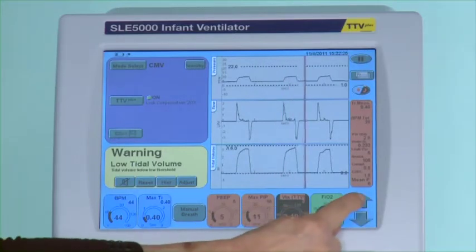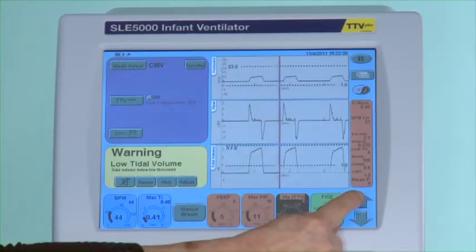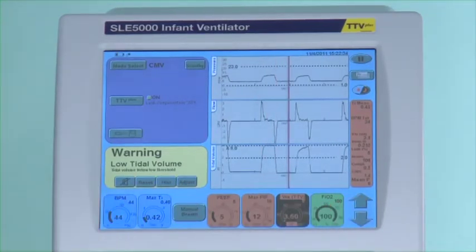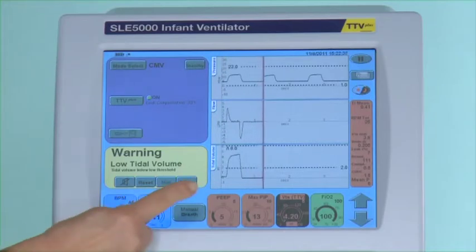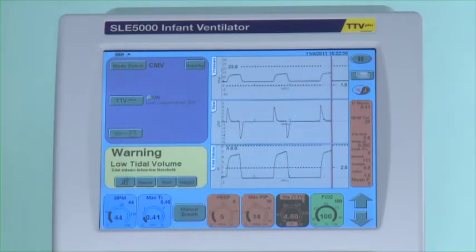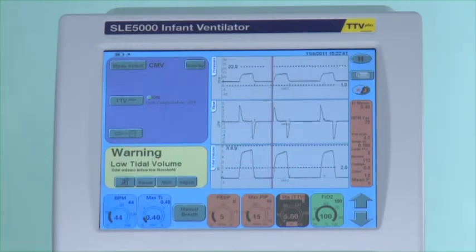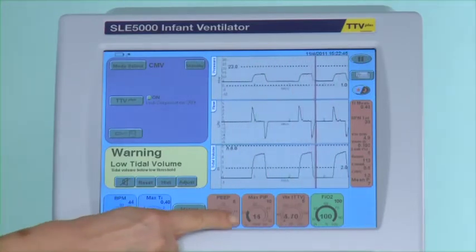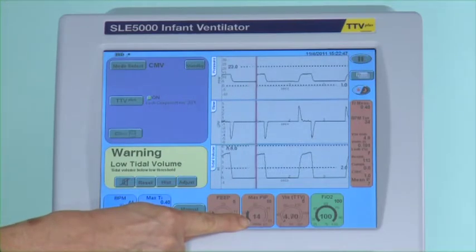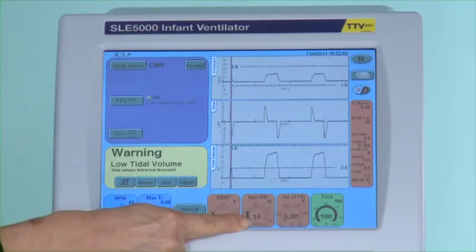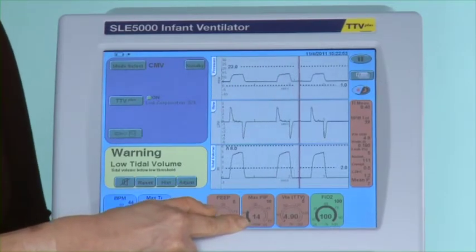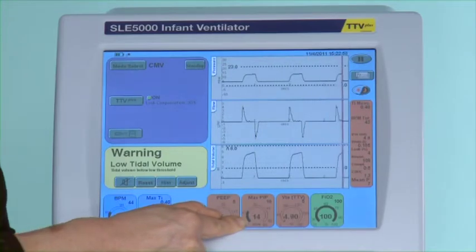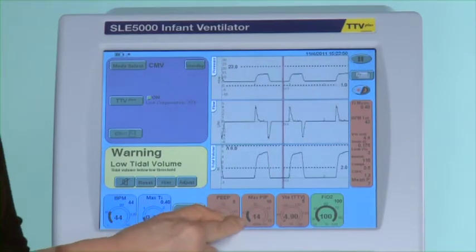I am going to select a tidal volume of 5mL. My peak inspired pressure was originally 18 millibars. To achieve 5mL of volume I am only needing to use 14 millibars of pressure. This is important for two reasons. I am reducing the amount of volume in the alveola thereby not over distending them, and I am also reducing the amount of pressure needed. These two points will reduce the amount of ventilator induced injury or volume trauma.